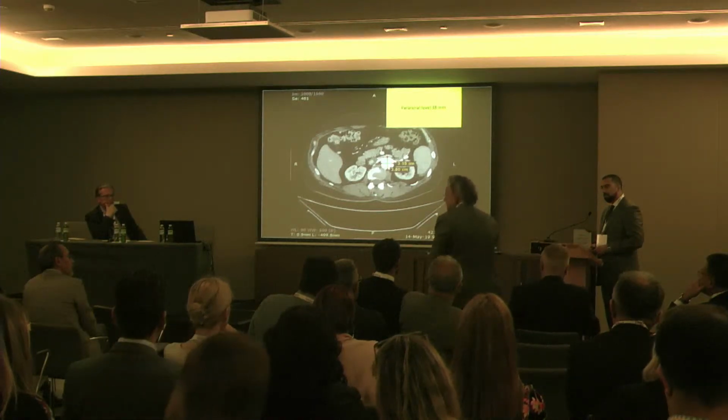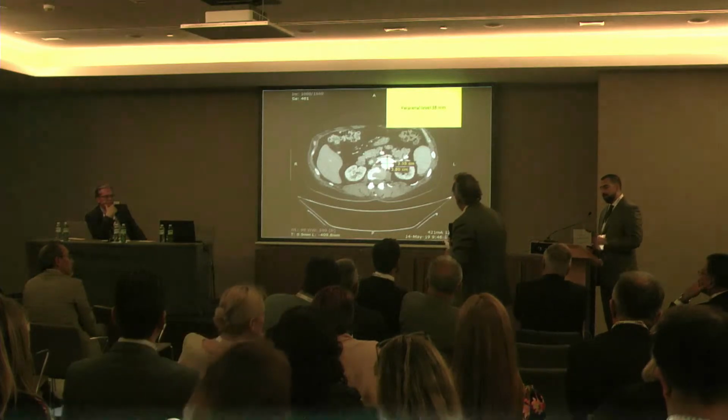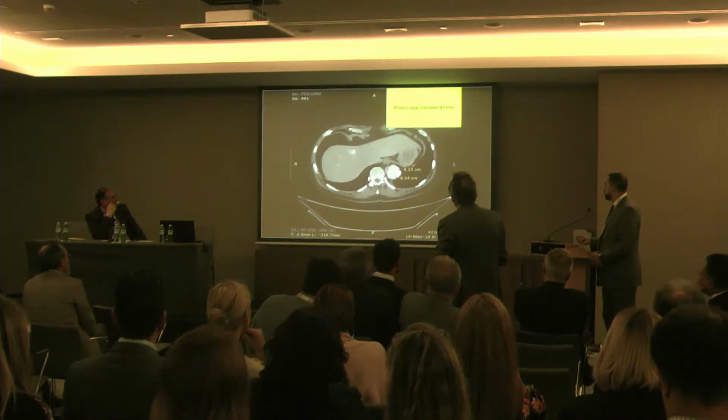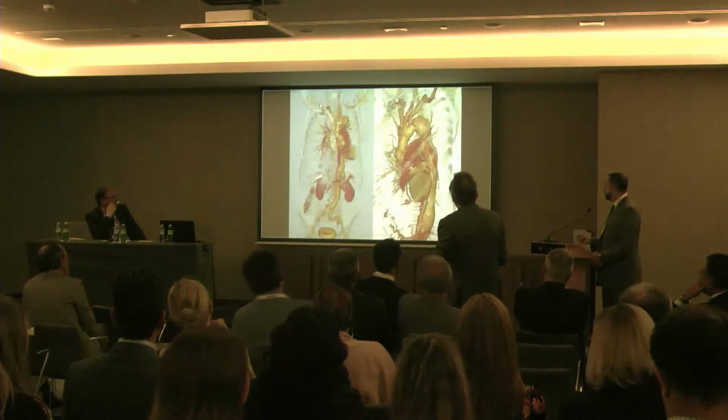Thank you. It's a Marfan, so I need the operation. The problem is the site of the clamping. Can I have the first slide with the 3D reconstruction? Yes.